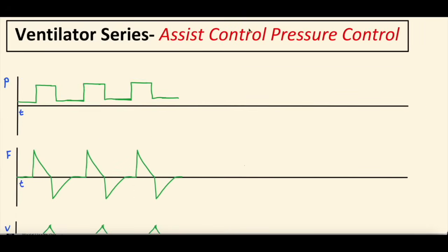All right, thanks for sticking around. So today we're going to be talking about assist control pressure control, also known as ACPC or assist pressure control, or many people in the clinical arena just refer to it as pressure control, and that's what we're going to refer to it as for the rest of this video.